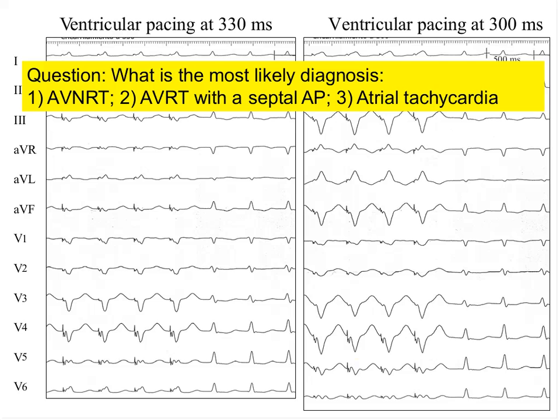So, Fernando, any comment? Yeah, let me stress this is a perfect example. Or let me go back to one of my prior comments by saying that in case of the positive finding, it's perfect, we are happy. But in case of the negative one, we should be cautious. So probably you will deal on it.